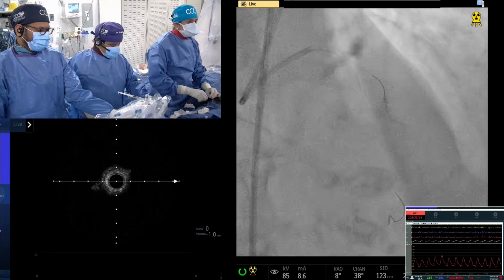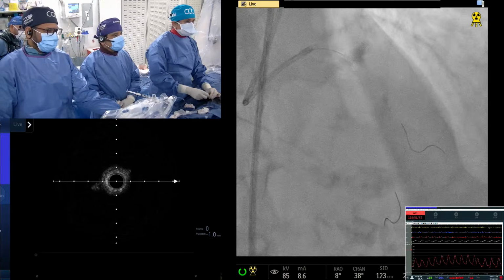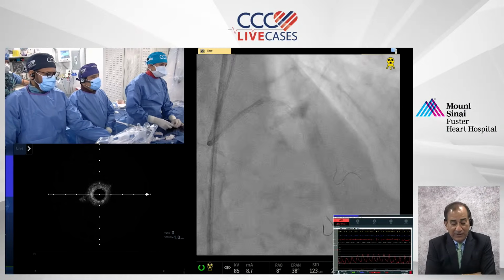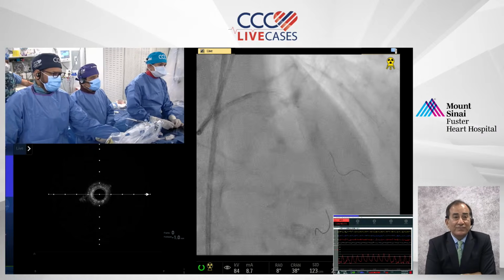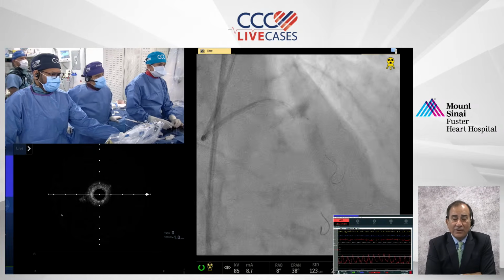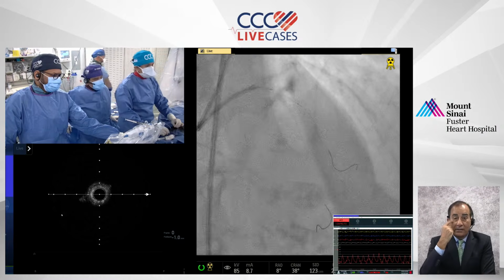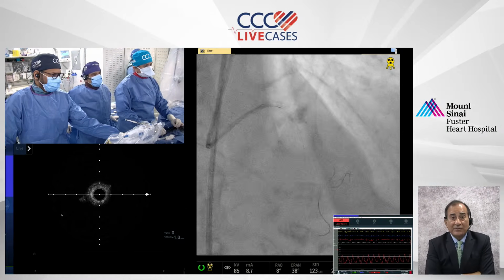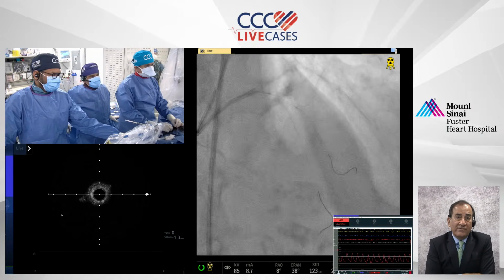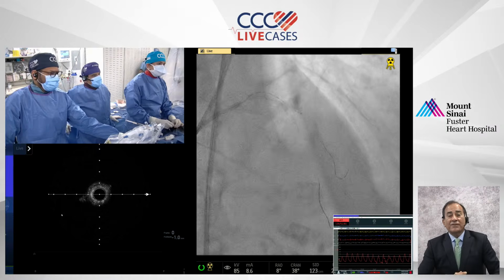Just to give you feedback on how the audience feels, several of them would have selected IVL here. Yeah, no, there's nothing wrong in that. I think what Dr. Kinney mentioned, it depends on your comfort level. Sometimes between two comparable techniques, that's a deciding factor. Plus, of course, I think you have to be mindful of the cost.